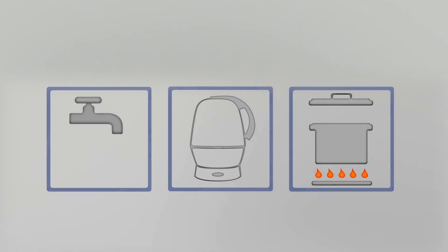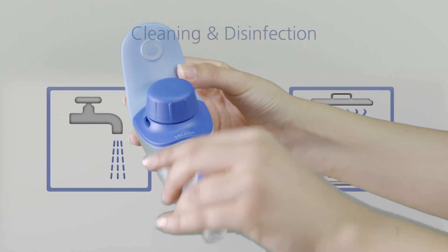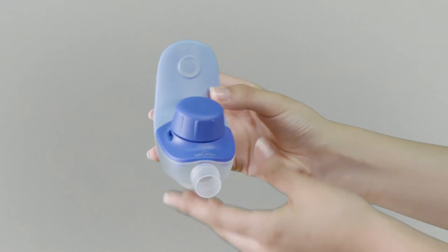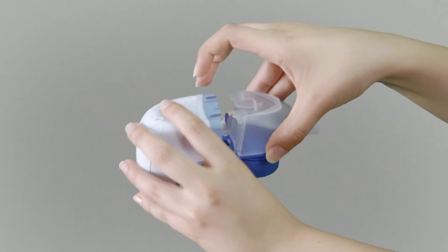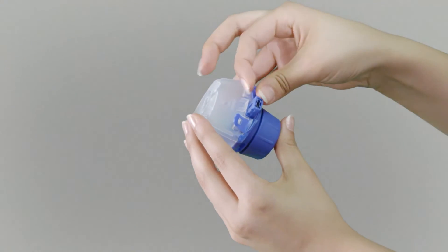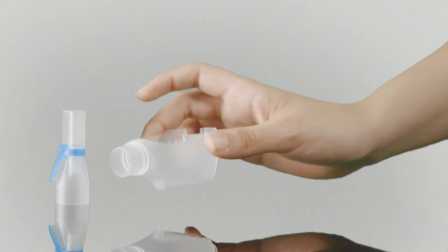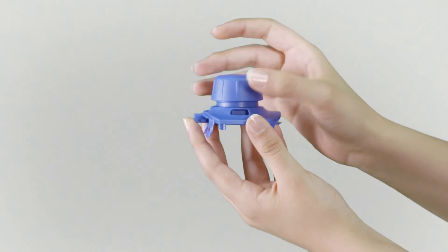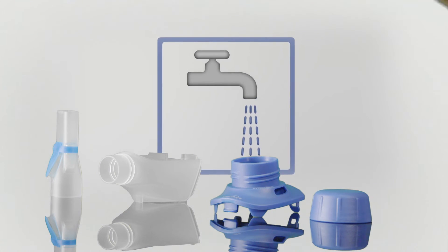The nebulizer should be cleaned after every inhalation session. First, remove the mouthpiece or mask from the nebulizer. Then remove it from the controller and dismantle it. Place all the components of the nebulizer, but not the controller, in warm water with some dishwashing liquid for around 5 minutes. Afterwards, rinse them thoroughly under running water.